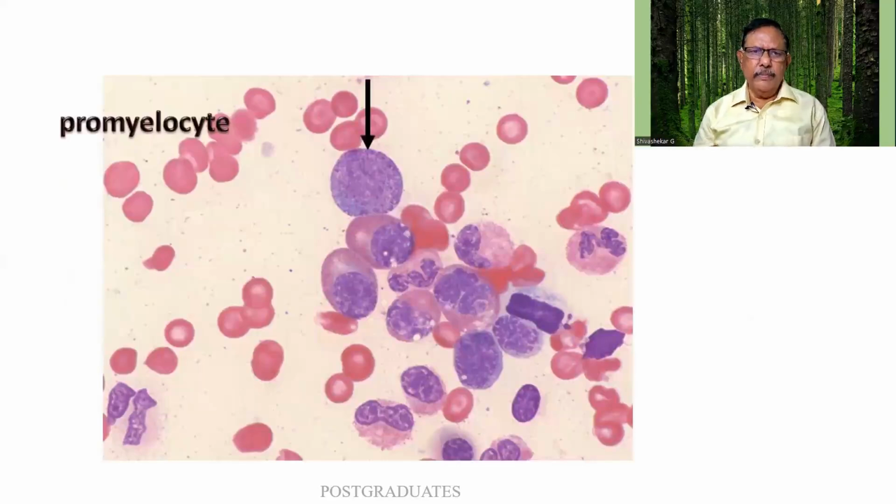from this. Look at this again. So it is a little hazy, not very darkly stained. I am finding a large round cell. There is an area of haziness over here, which is the nucleolus. The other cells do not have such features. They are much smaller. So now I hope you people are able to appreciate about 2 to 3 nucleoli. Over here, the chromatin is slightly opened up.